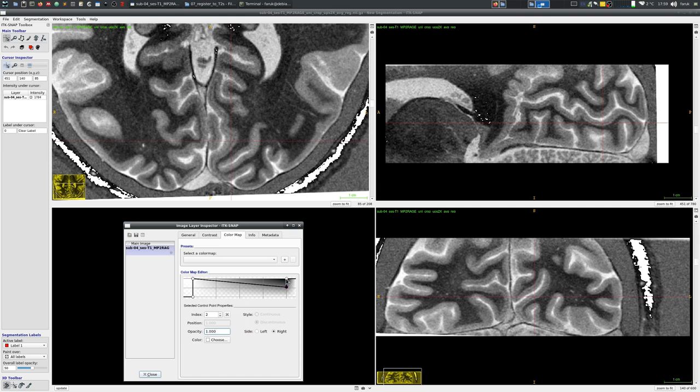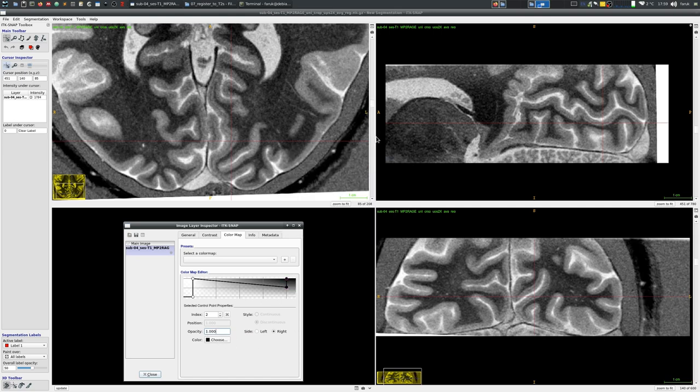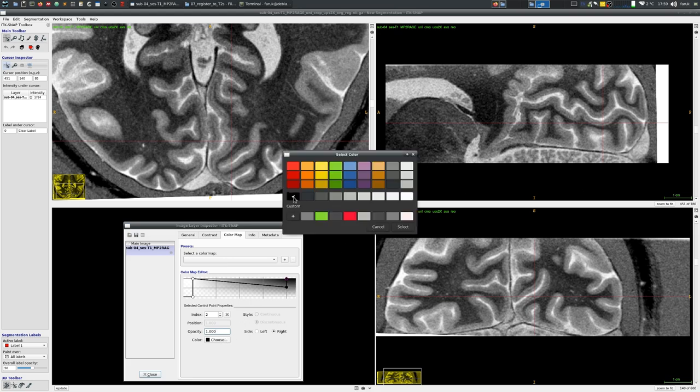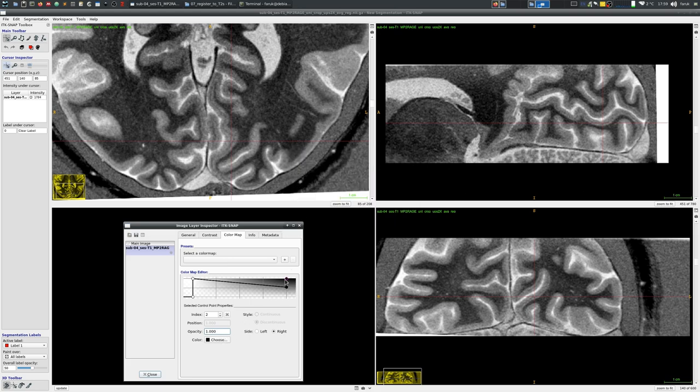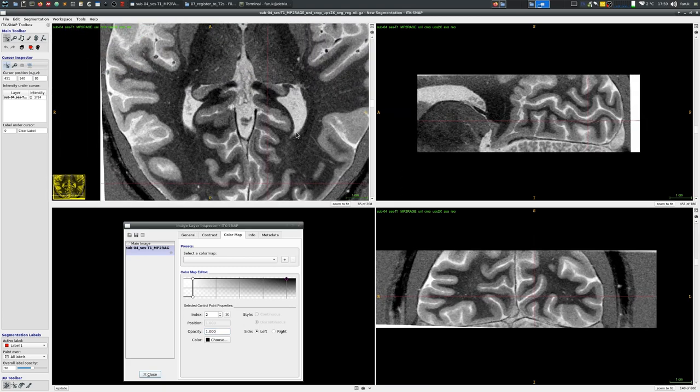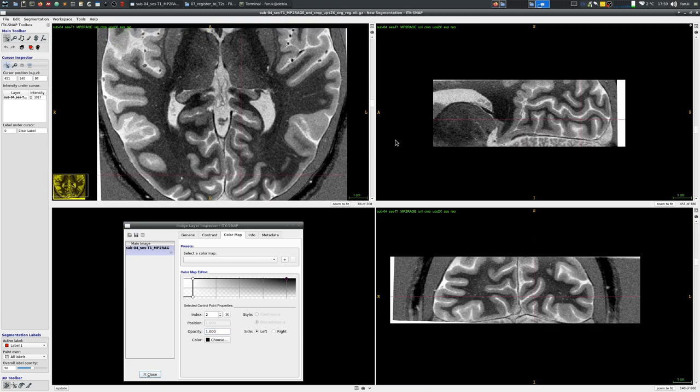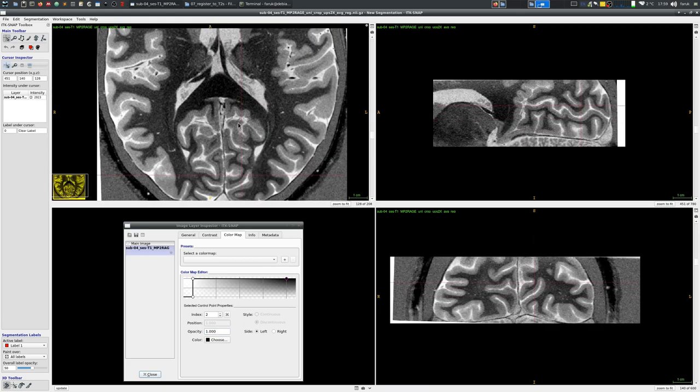The result of this is that you end up seeing the image with an inverse grayscale. Now you can see the image with an inverse color map.